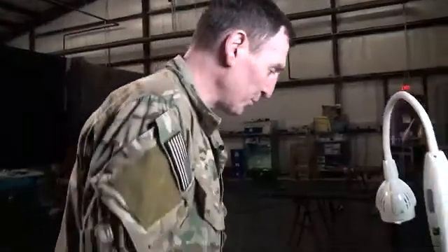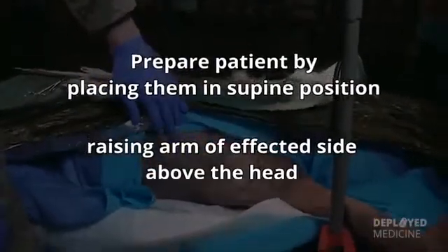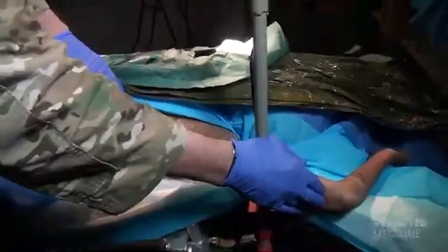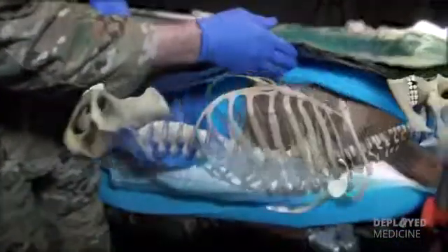The first thing we're going to do is prepare the patient by putting them in the supine position and go ahead and have the affected side of that arm raised above their head. We're going to identify the area and then clean it appropriately. In this situation, it's the left side of the chest.